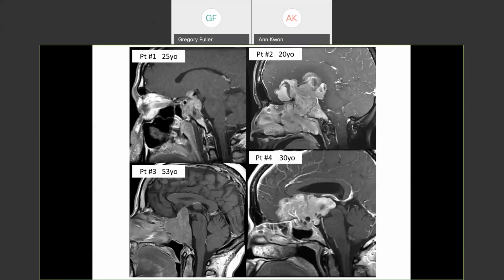Anybody want to pop up? Yes, Dr. Trivedi says chordoma. Absolutely. Dr. Cathcart: olfactory neuroblastoma, chordoma, pituitary adenoma. Okay, no, wait a minute. Dr. Cathcart put pituitary adenoma. Are you kidding me? Destroying the clivus? And the answer says yes, absolutely.